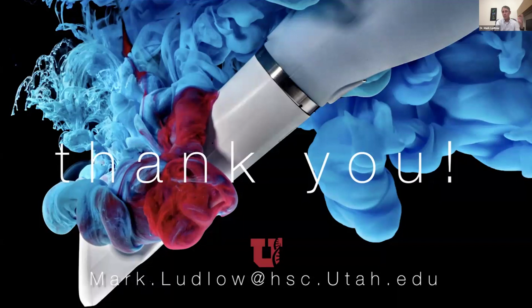And so use the right modality for the right tool. There's nothing wrong with taking a PVS if you need to. And I think sometimes we get so into this camp of, well, I'm only scanning everything or I'm only PVSing this. The reality is use the best tool for the right job, okay? I haven't taken a diagnostic impression of a patient. I can't remember the last time.